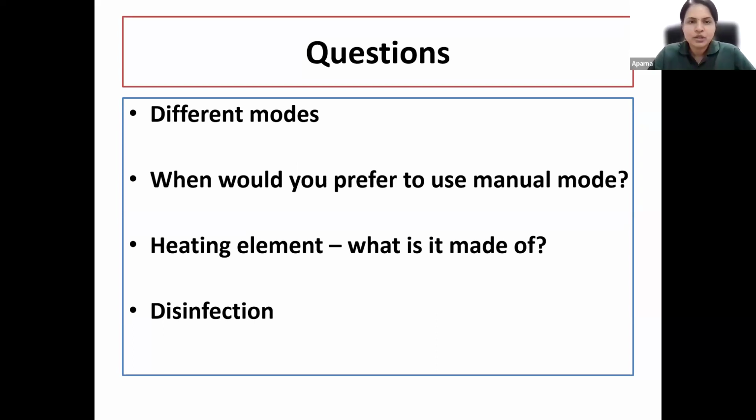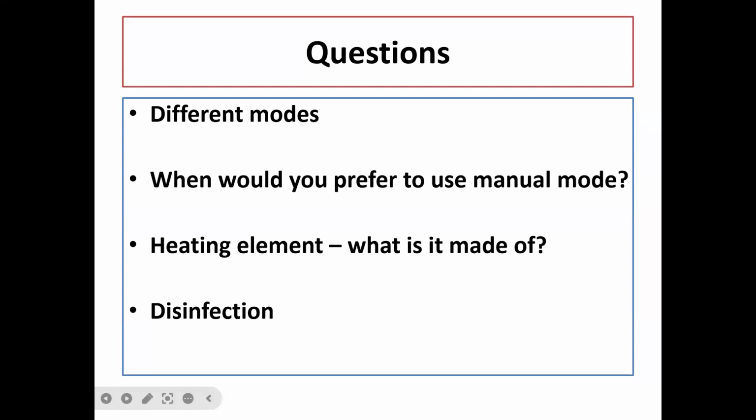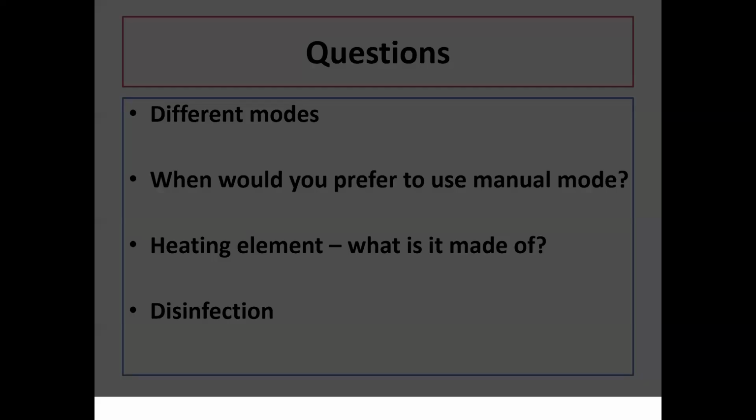The other situation is when we are going to receive a new admission in the unit. Again, we will use the manual mode. Similarly, we may use the manual mode when you are dealing with a baby with fever, because when the baby has fever, then the servo mode will end up detecting higher temperature and this can result in reduction in the heat load.